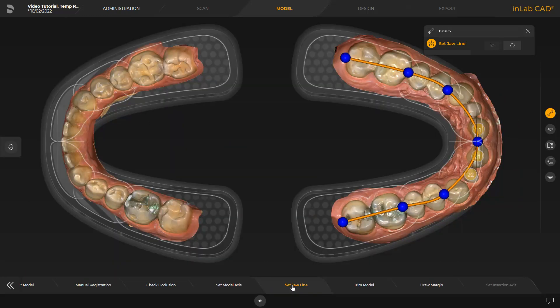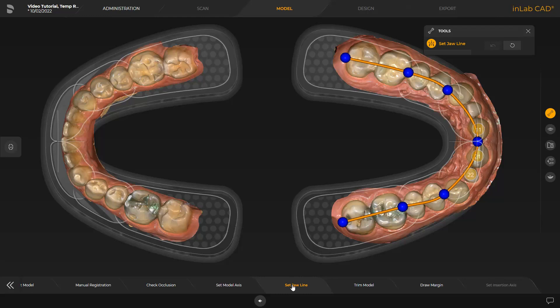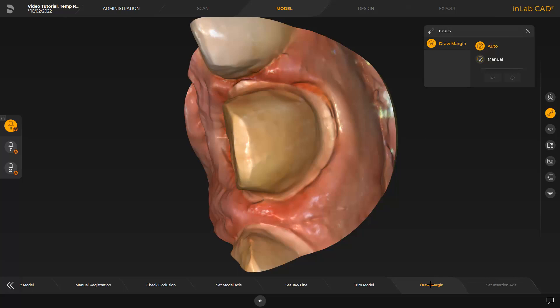We have adjusted the Jawline accordingly and switched to the Draw Margin step. The Trim Models step in between is performed automatically by the software. To draw the preparation margin, we start with a double click and keep placing single clicks, finishing with a double click. Since this video is focused on the workflow, we skip the drawing process and next you see the preparation margins already defined.